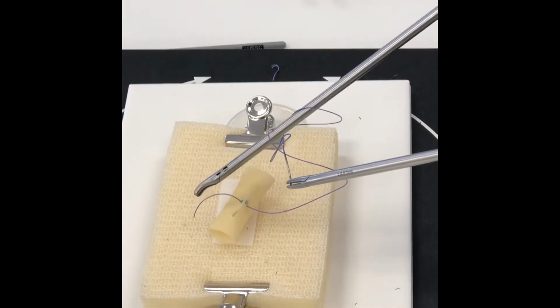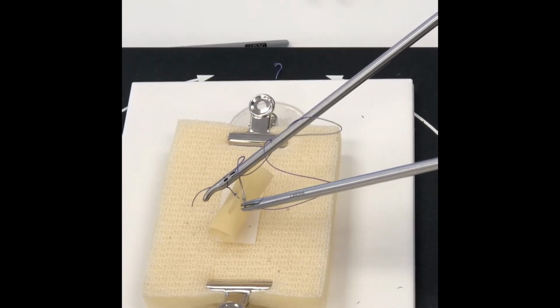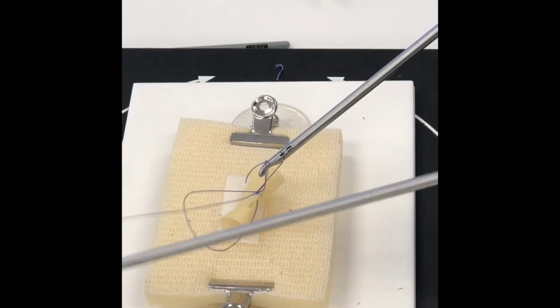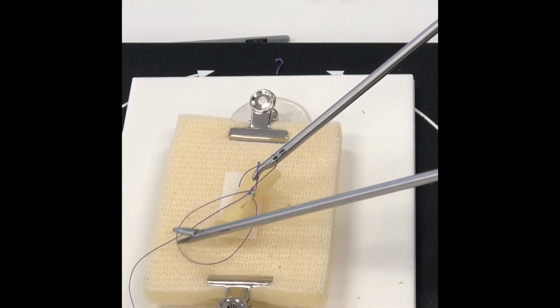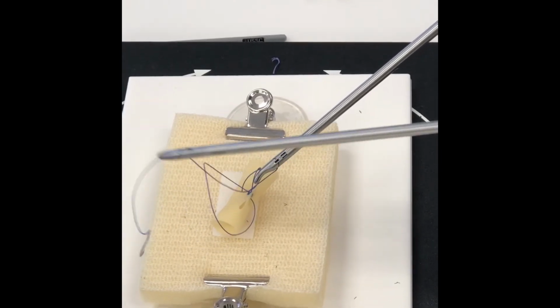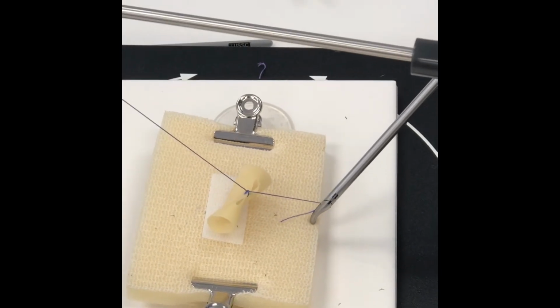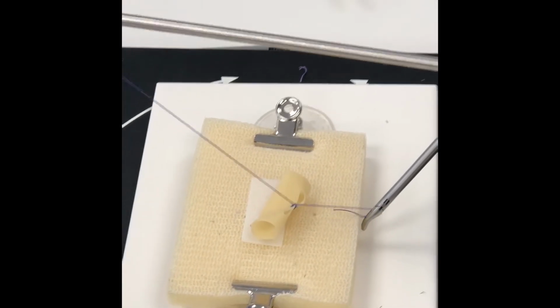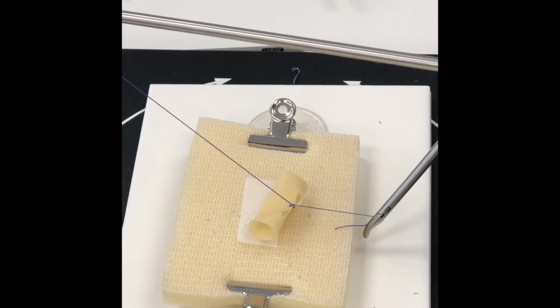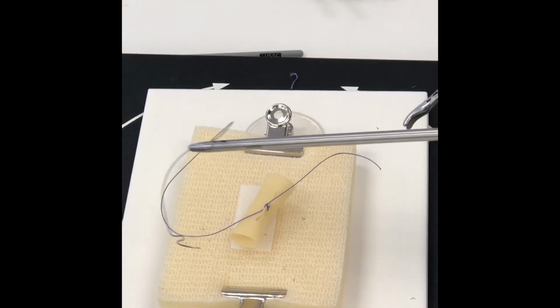Then you want to grab towards the tip of the tail, and every time I grab over on my first one, I bring the tail down on the first knot throw. If I'm grabbing the needle, I have to let go and re-grab so that I keep the tail nice and short. Okay? So first throw, I go over, tail goes down. Then I let go of the tail and I'm going to bring my suture towards my tail.